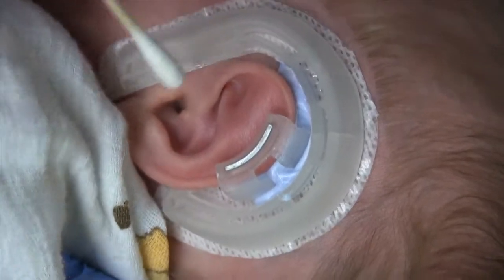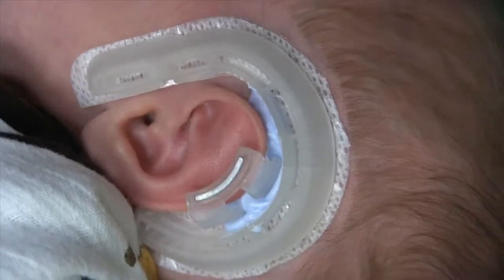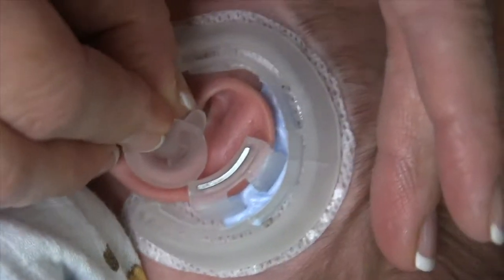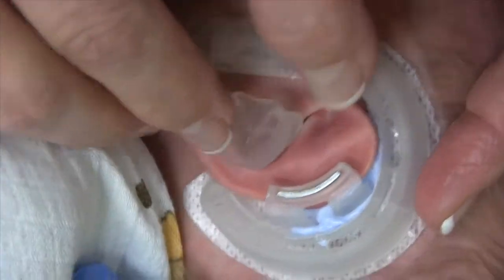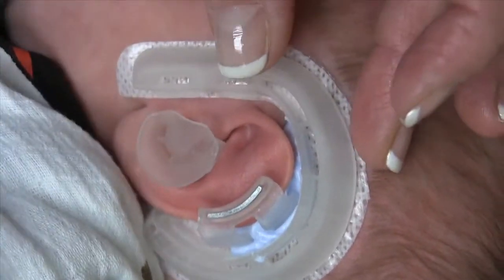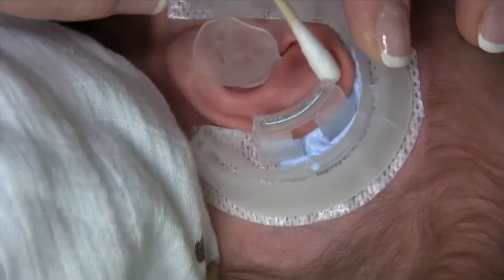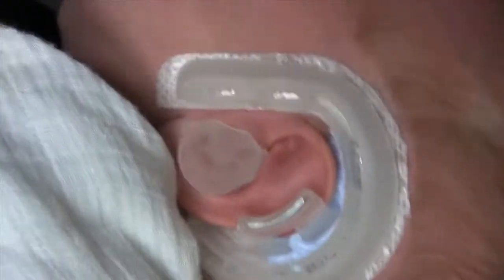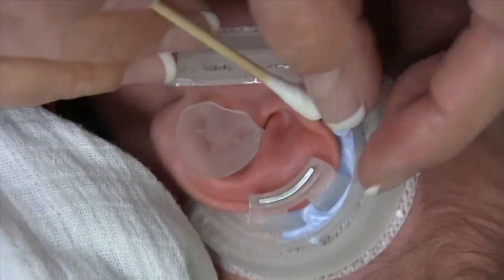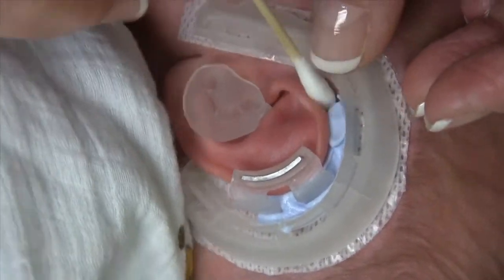We've got a nice curvature around here and a nice superior crus formed. We'll put the conchal former in, and then we can put the anterior cradle on. We'll put just a little bit more back here to really enhance that curvature.